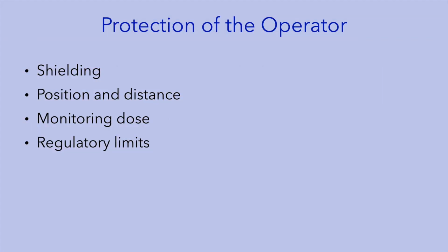As an operator, you can reduce your dose by using shielding or by using position and distance. You can monitor your dose on a periodic basis to ensure that your practices for dose reduction are effective and to document that your doses are within the limits.